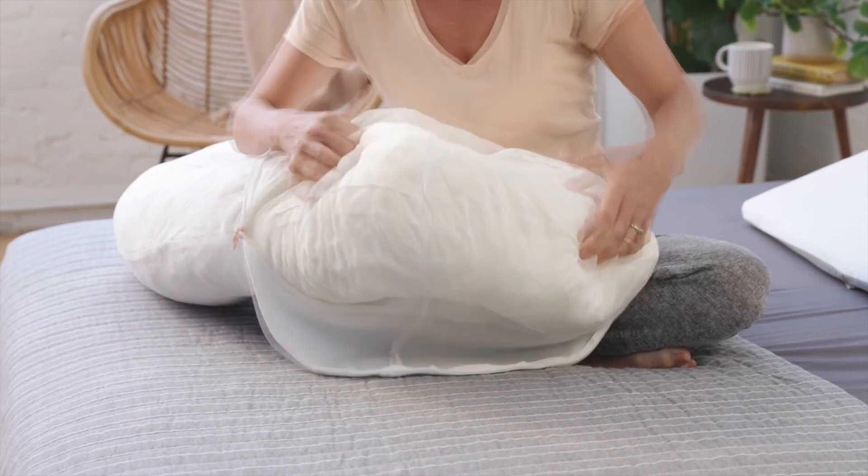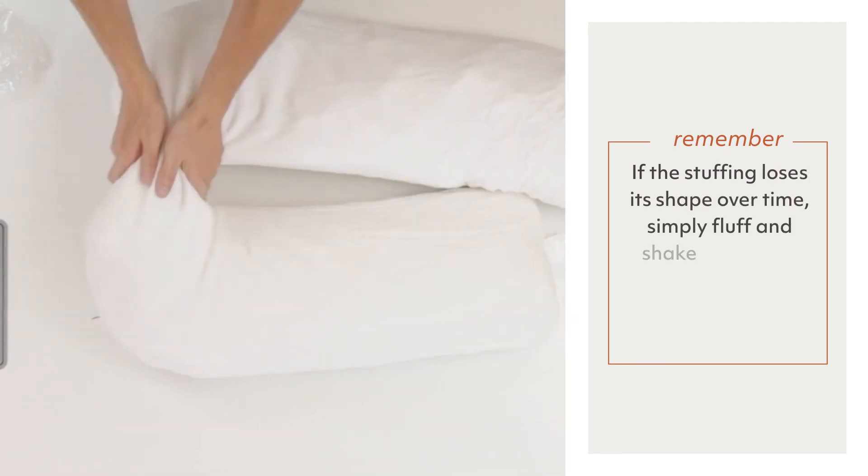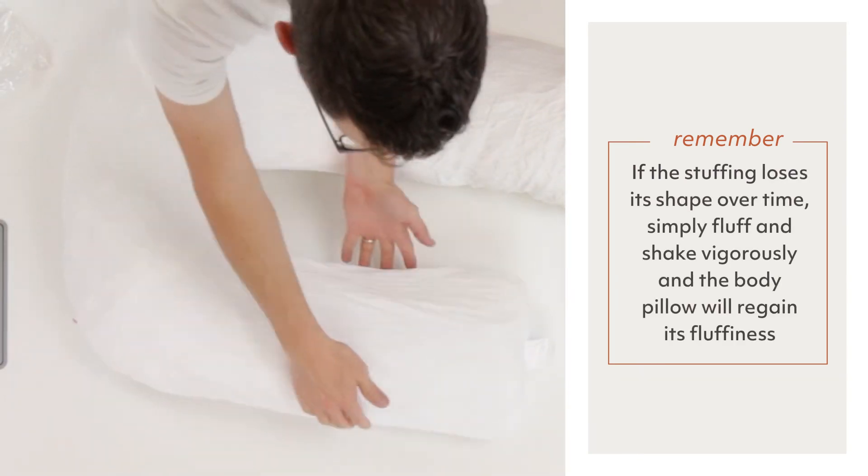You can also make similar adjustments for your head and neck. If the stuffing loses its shape over time, simply fluff and shake vigorously and the body pillow will regain its fluffiness.